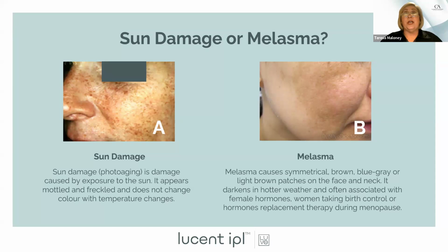For example, which we're going to show in our skincare part, Bella MD, doing a facial on it, keeping it down, suppressing it, wearing sunscreen. These are things that we will go through. It will manifest again, whether it's in 6 months, whether it's in 9 months, that you can go back to another IPL treatment. You just don't want to do them in a series when you're dealing with melasma.